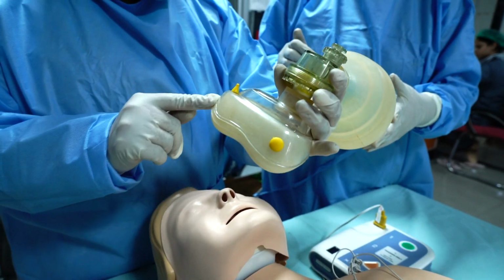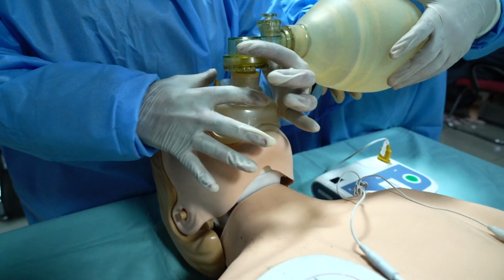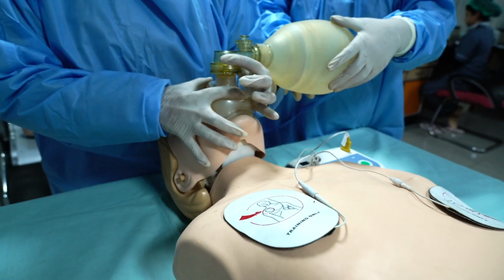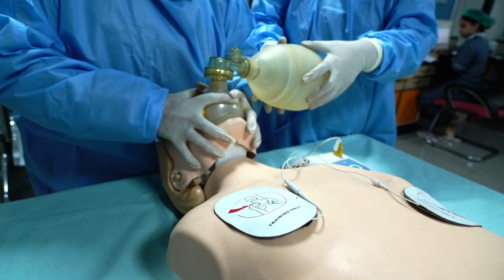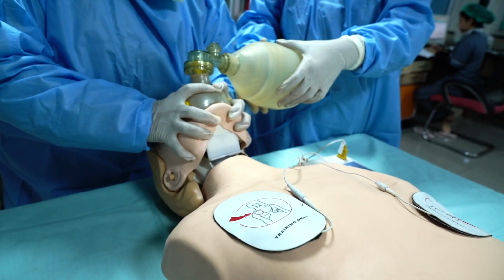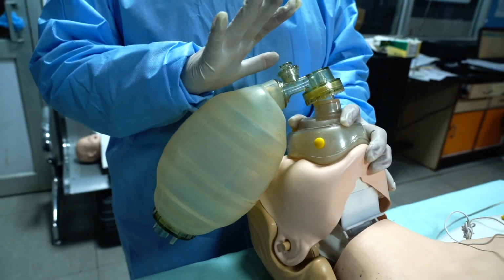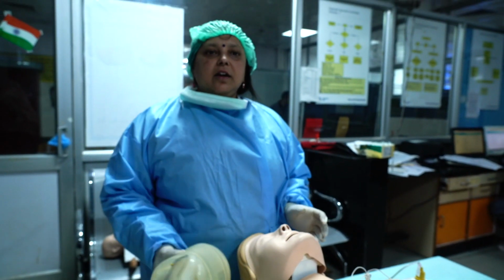We have to put this pointed part over the nose and the broadened part over the chin. You may apply the C and E technique, and you can use both hands so that there is an adequate grip, and give 2 breaths, each breath of 1 second, with chest rise. This has been demonstrated in the airway session. The airway part has been covered in the airway session, for performing CPR or resuscitation measures.